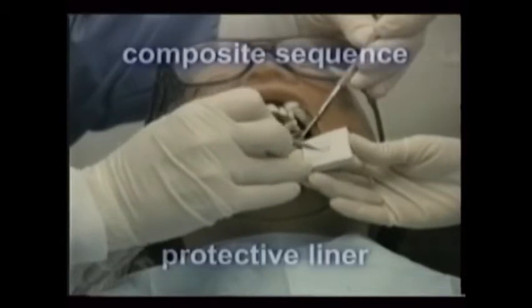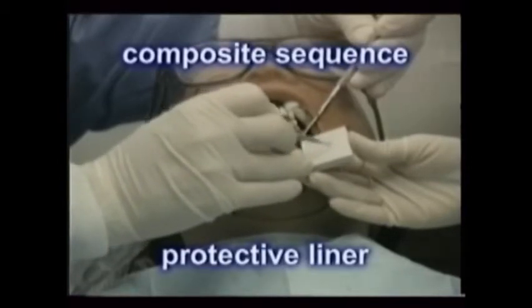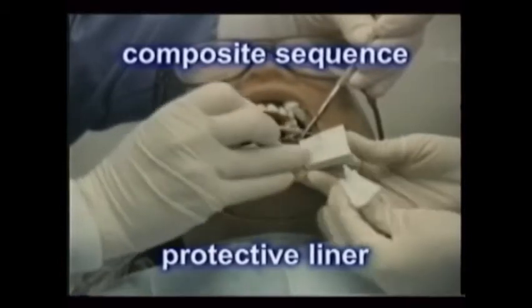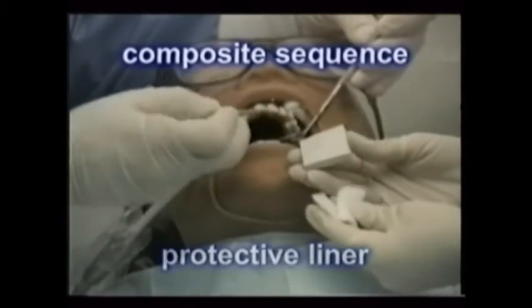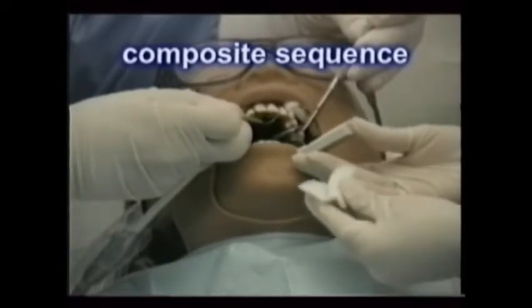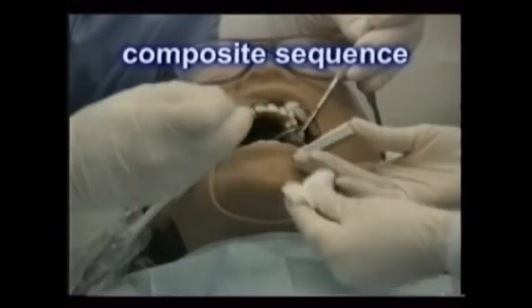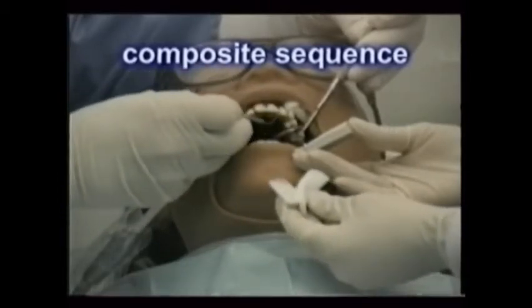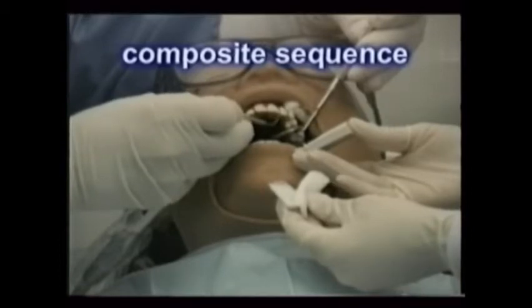The calcium hydroxide base, like the Dical brand, helps insulate the dentin from the acids used to roughen the surface to bond to, and also helps neutralize the acid. Calcium hydroxide is mixed on a small paper pad. The tip of a calcium hydroxide mixing and placing instrument, or even a periodontal probe, helps carry the paste to the cavity preparation.